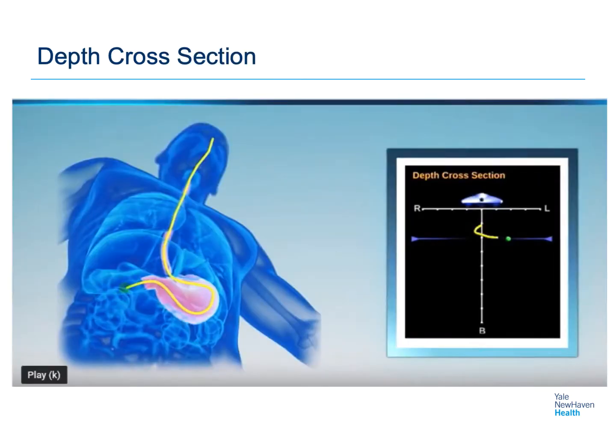As you can see on this screen, when the tube does navigate through the pylorus, it then starts to go into the small intestine. In this picture, the tube is crossing through the pylorus into the first section of the duodenum. You can see that as it starts to move into the small bowel, the depth cross-section on the display unit starts to show you dropping, and the tube is going retroperitoneal. That is another mechanism that helps us confirm placement and where we want our tube to be.